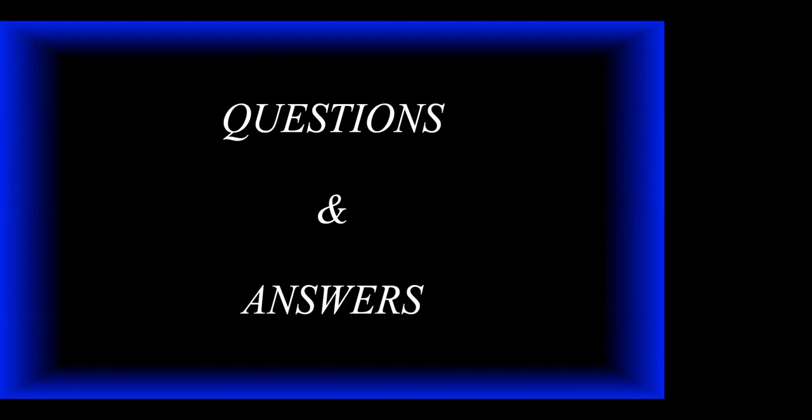I've done 3 studies. One is myself at the Mish Institute, and 2 I've done with Temple University perio residents, where we've looked at the percent of patients that have pathology in their sinus that are asymptomatic. And our studies range from about 38% to about 46% of the population have some type of pathology. So this little webinar today hopefully will give you some insight into what you will see on about half your patients, this sinus pathology. And this is very easy to understand and learn.